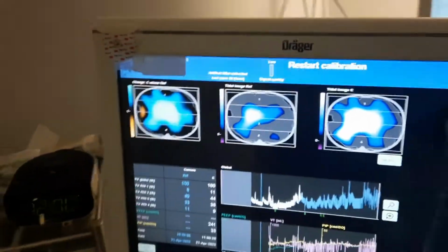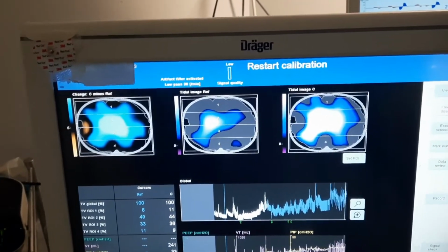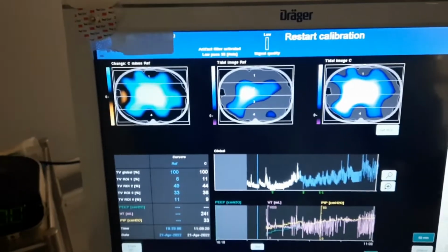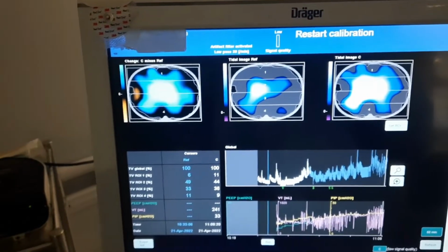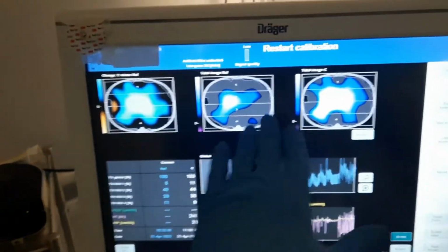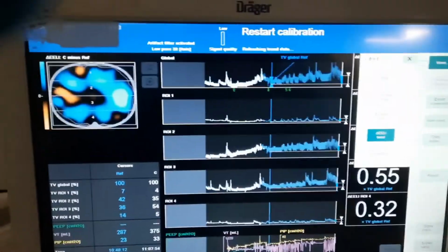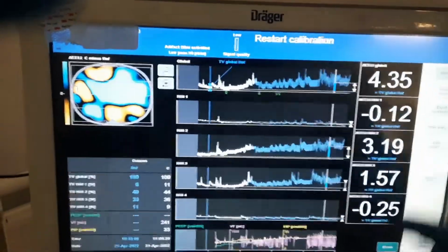So there's global tidal volumes at the vent settings, but it's also important to think about the micro level, the alveolar tidal volume. The minute that you're recruiting more alveoli, then the whole alveolar system has the job, the work, dispersed more evenly. So we're seeing definitely this opening up on inspiration, but what we're trying to do here is the end expiratory lung impedance, which represents end expiratory lung volume.